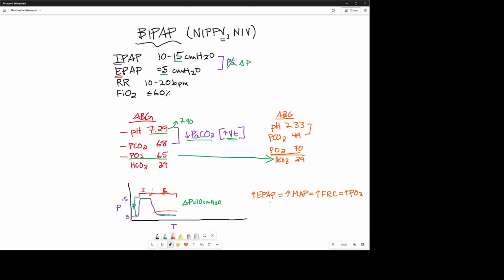So that's kind of a chain you can follow in your mind, I guess. Now, when you increase the expiratory positive airway pressure, you are increasing the baseline pressure level seen by the alveoli and the airways and the lung tissues for essentially a longer time interval during the inspiratory and expiratory phase. That's what makes EPAP and PEEP and CPAP pressure changes very effective to drive oxygenation.